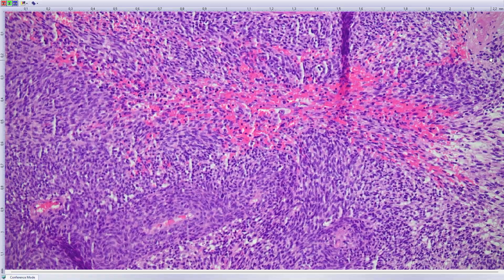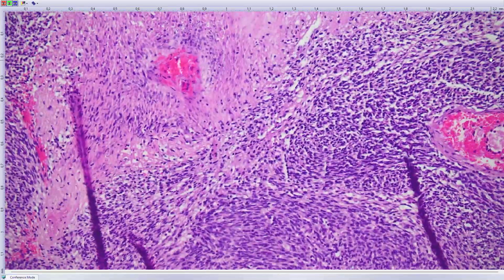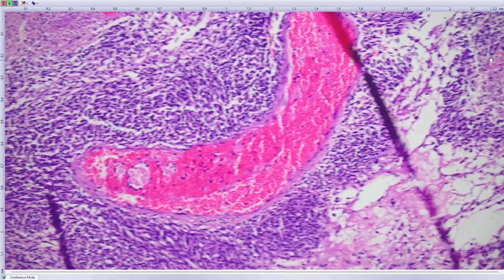Okay. Where is it exactly located again? Sorry? Where is it located again? It's a supratentorial brain tumor. And it looks almost like MPNST. Looks like MPNST, yeah. Okay. This was my first thought.